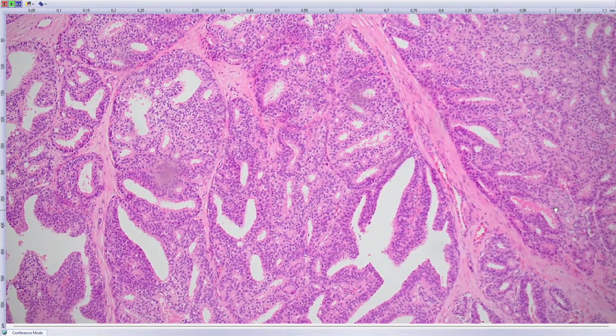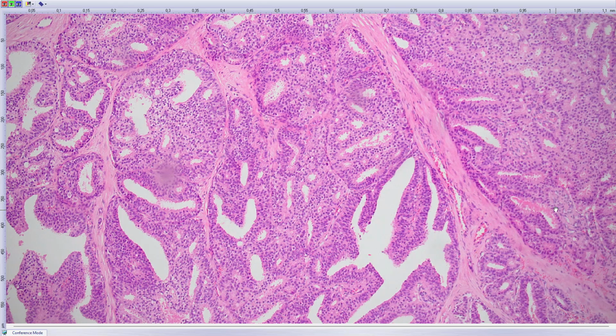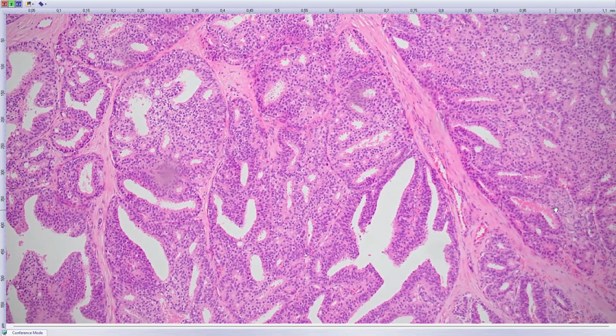It's what? No? Prostatic adenocarcinoma. Yes, it's metastatic prostatic adenocarcinoma. Prostatic metastatic adenocarcinomas of this architecture have nearly always apocrine-like differentiation. Yeah? So do not confuse it with primary tumor. The patient should be treated for prostatic carcinoma.